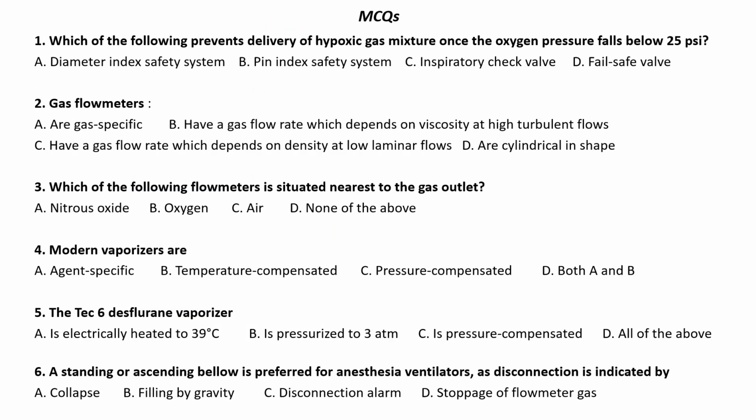Okay, and here are some MCQs. I need you to answer them. Which of the following prevents delivery of hypoxic gas mixture once the oxygen pressure falls below 25 psi?